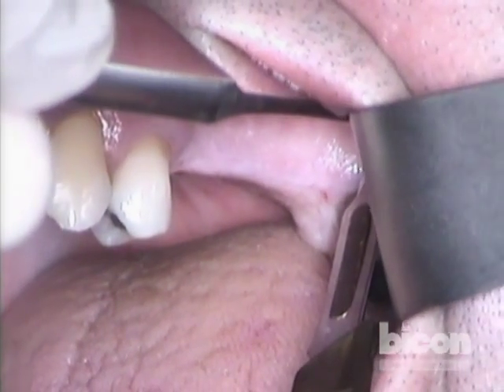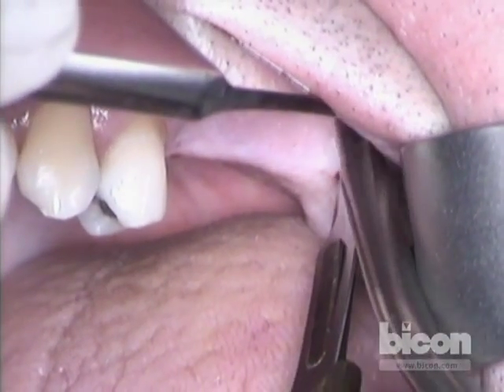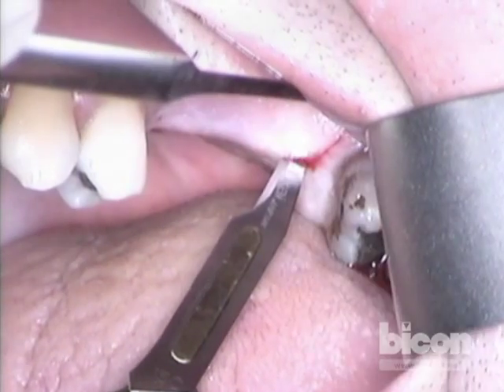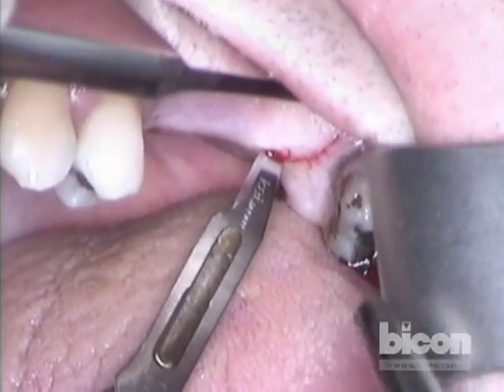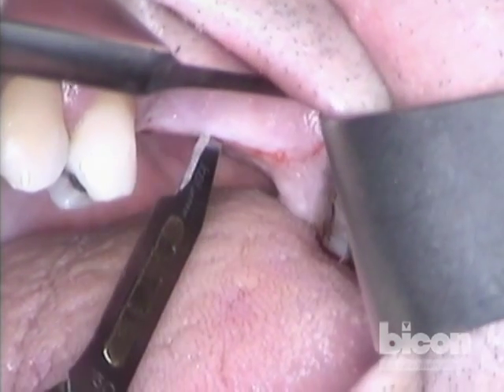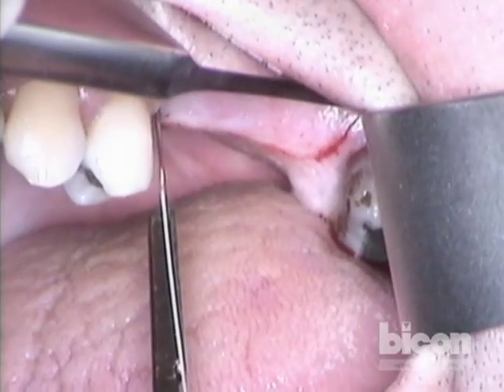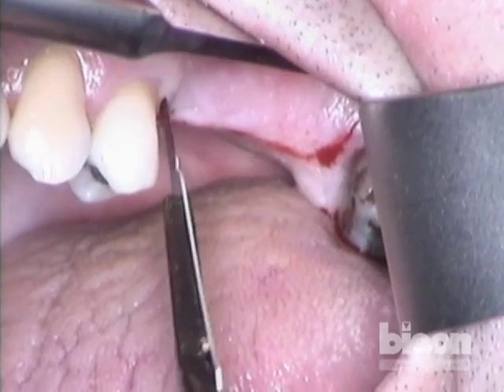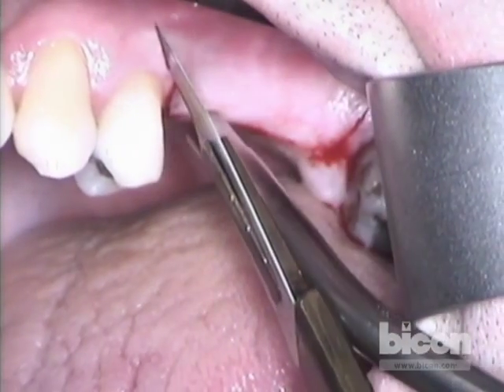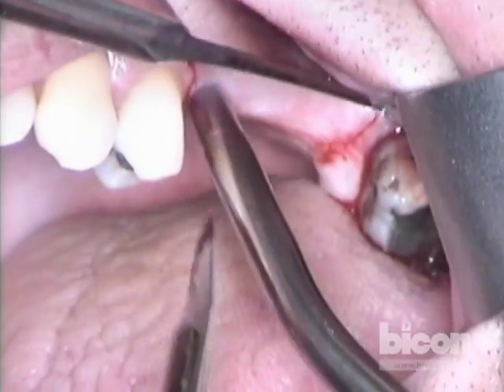Our incision will be curvilinear, starting from the posterior using a 15c blade. We'll hug the palatal slope of the crest and continue the incision right to the edge of the healed socket of the second bicuspid. We will then make a releasing incision, extending it slightly just past the mucogingival junction to allow better mobilization of the entire flap.